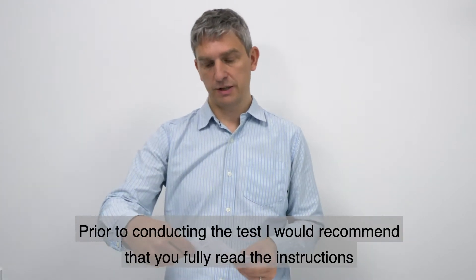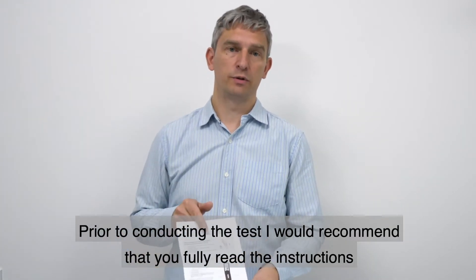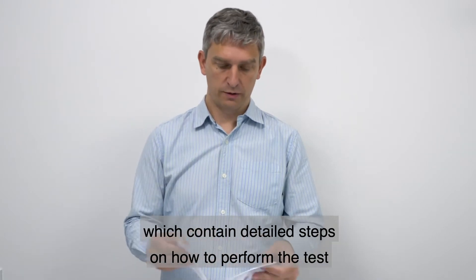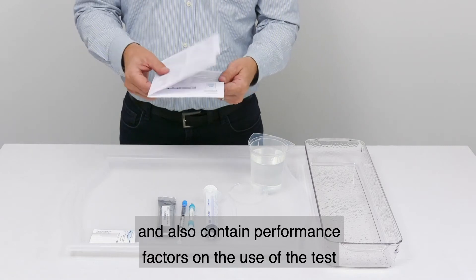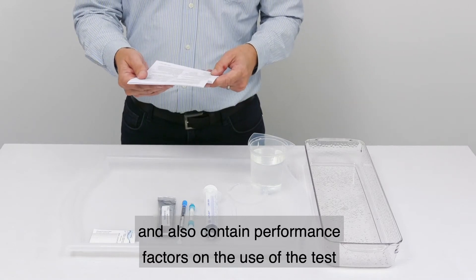Prior to conducting the test, I would recommend that you fully read the instructions, which contain detailed steps on how to perform the test and also contain performance factors on the use of the test.